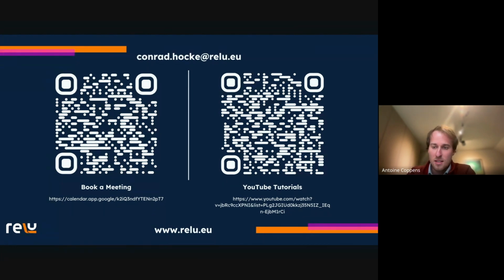But regardless, it's still the goal for us to include several libraries. The first one that we're integrating right now will be from Biotech as well, and then we can hopefully already start making some real guides then.